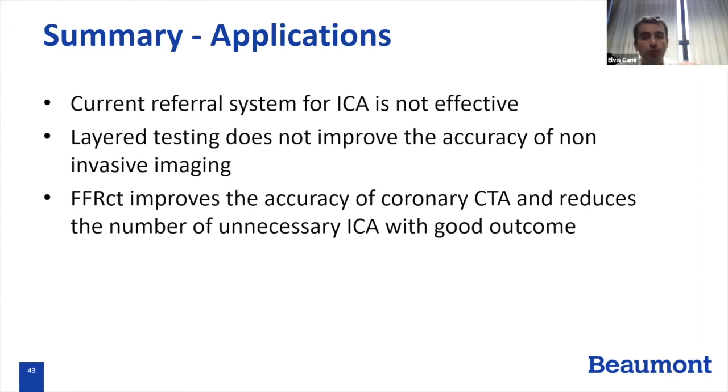On the few that are done with calcium score, sometimes the calcium score will be like 2,000, and the tech will call me and say, hey, the score is 2,000. Do you want to do the CT or not? 100% of the time, we'll do the CT. So you're not using that to actually stop the exam. Correct.